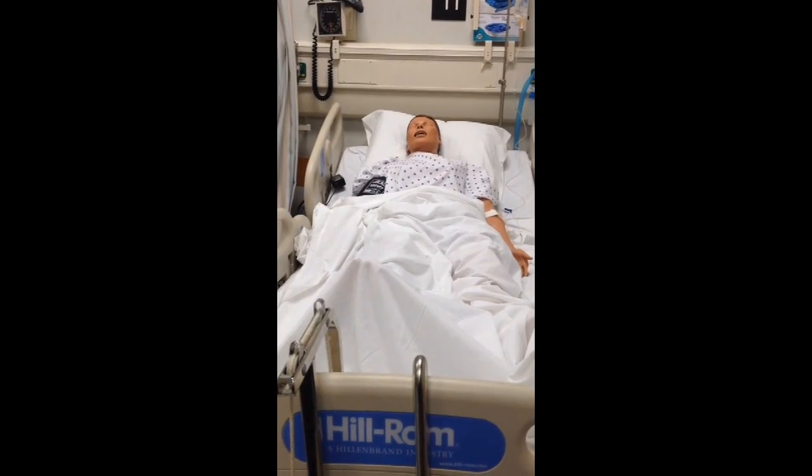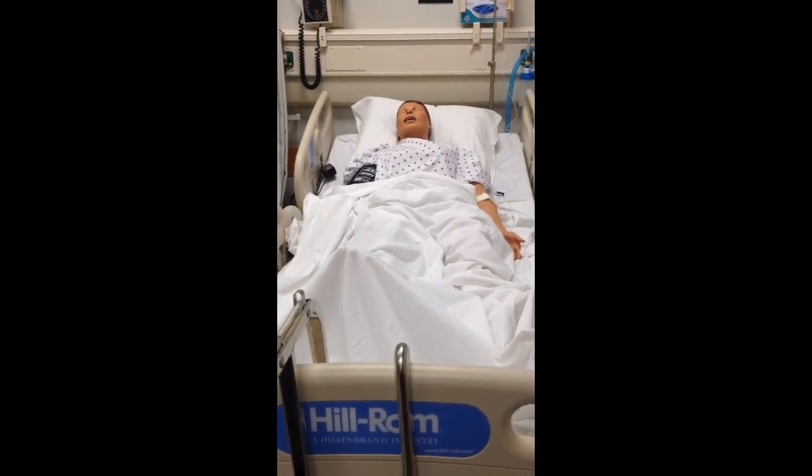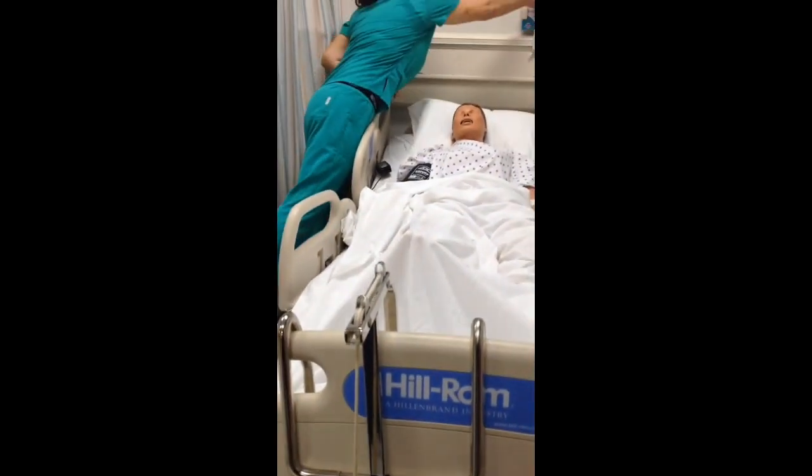This is a demonstration of caring for a patient with skin traction. Hi, my name is Summer. I'm going to be your nurse today. I'm washing my hands and I'm going to get some gloves on.